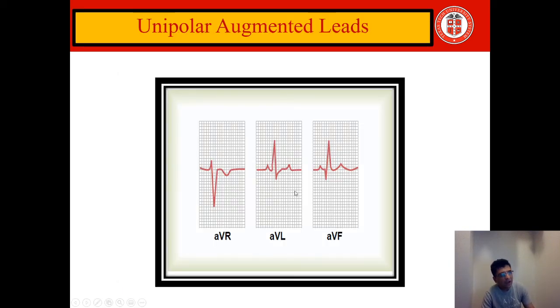Now, this is a kind of a design which you see with the augmented leads. The idea is just to familiarize you that this aVR always has an inverted wave normally. So if this one is positive, which means we have some kind of anomaly.